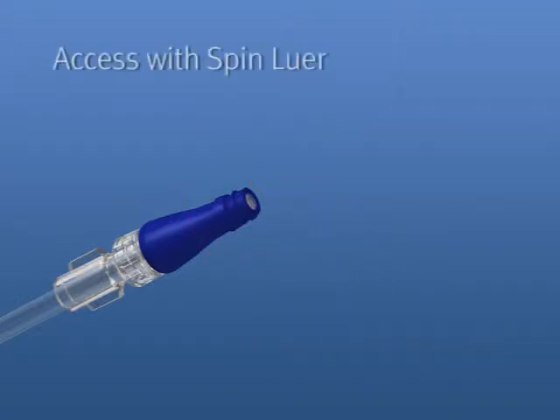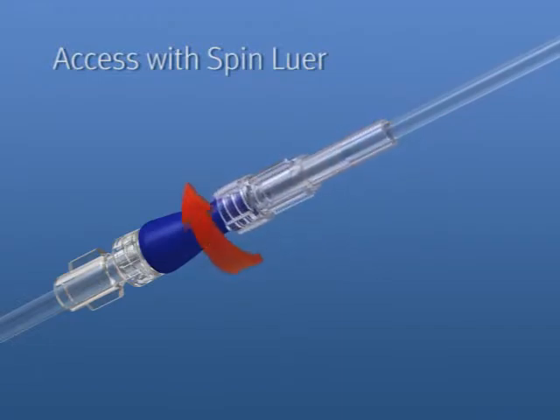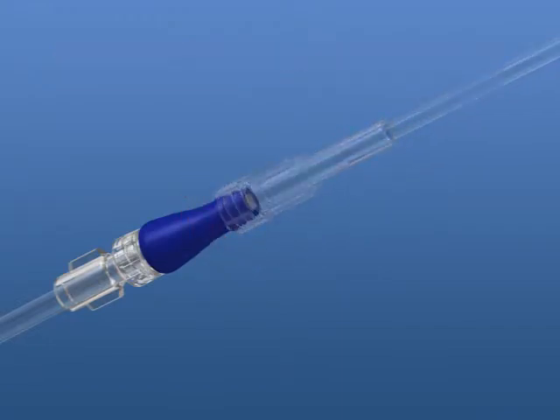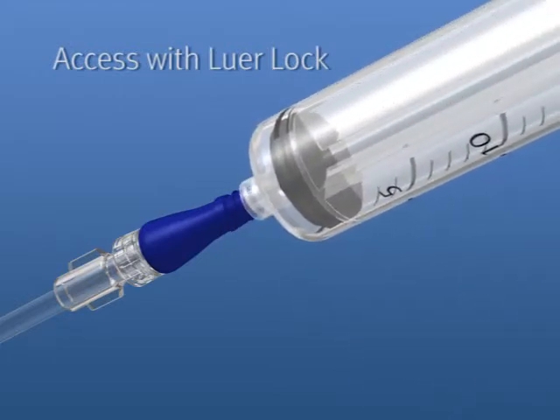To access the MicroClave with a spin luer, swab the top of the MicroClave with alcohol and then push and twist the luer slip into the MicroClave until secure. Twist the rotating collar to lock. To connect to the MicroClave using a luer lock syringe, swab the top of the connector with alcohol and push and twist the luer until secure.